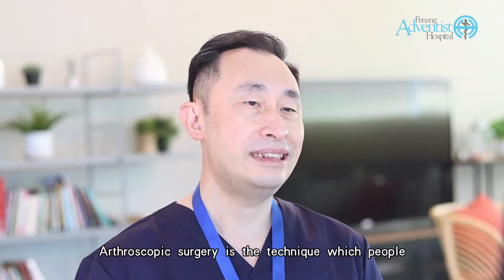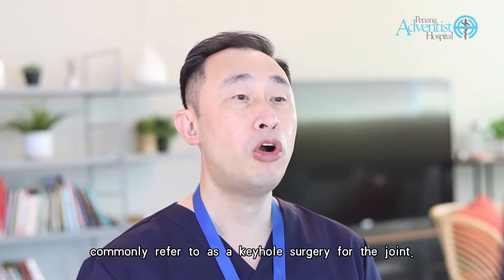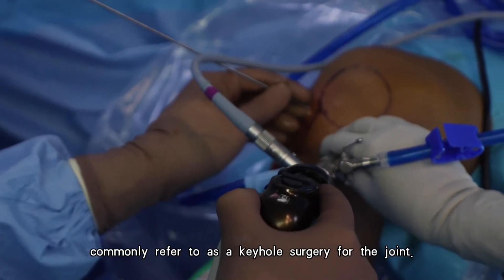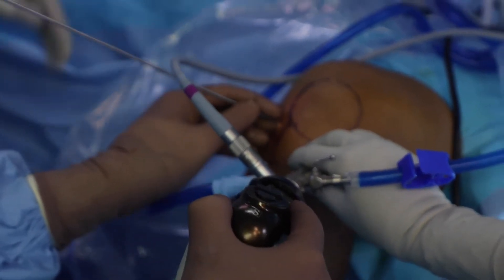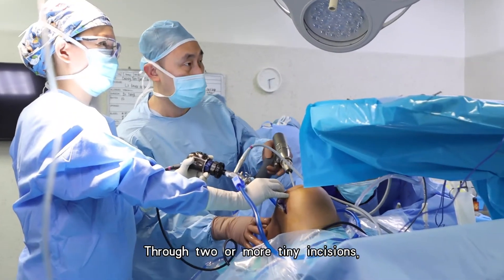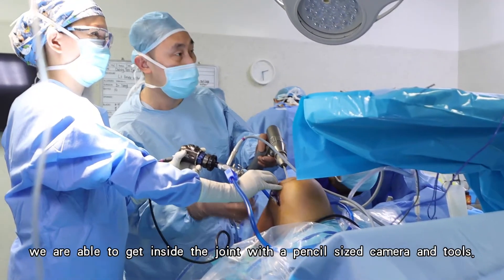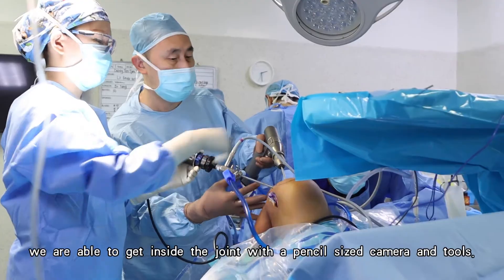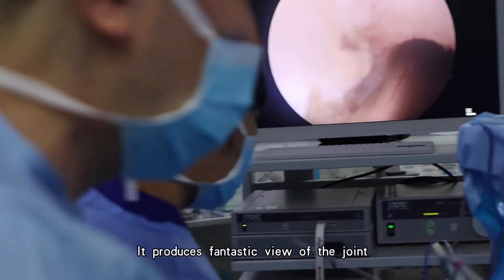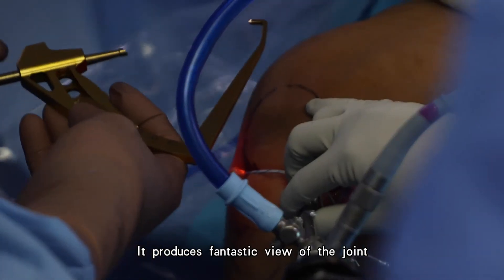Arthroscopic surgery is the technique which people commonly refer to as keyhole surgery for the joint. Through two or more tiny incisions, we are able to get inside the joint with a pencil-sized camera and tools, and it produces a fantastic view of the joint.